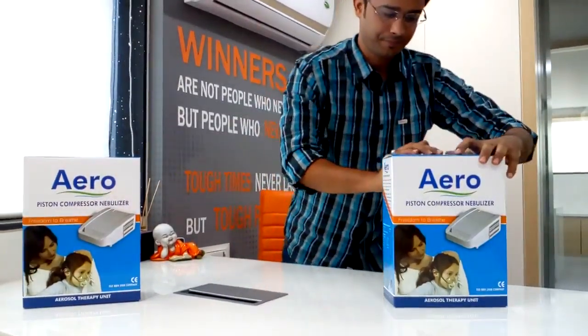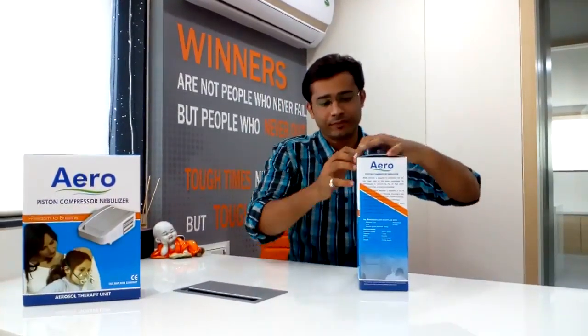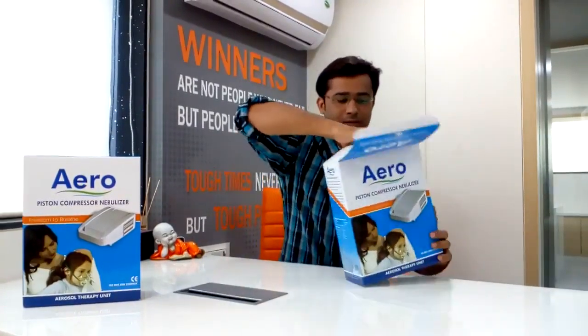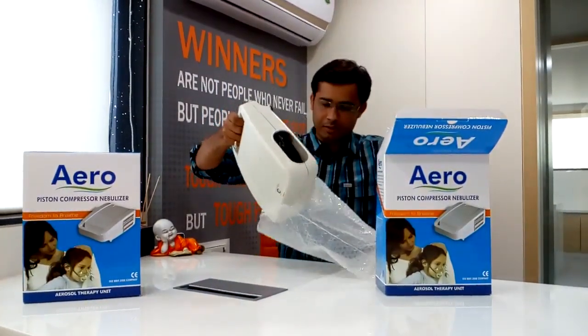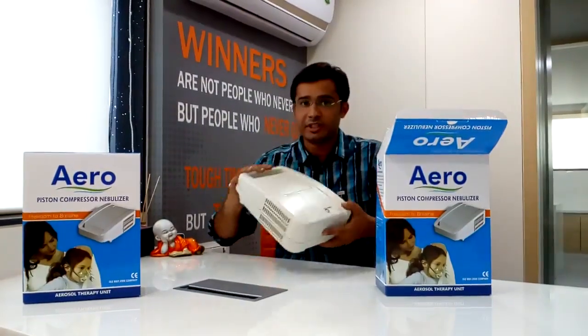Welcome to Heman Surgical Industries Limited. We are manufacturers of nebulizers. Now I will give you a demonstration of how to use a nebulizer.